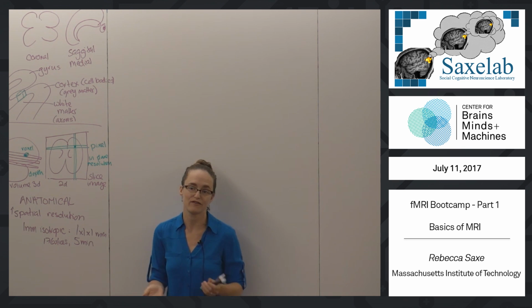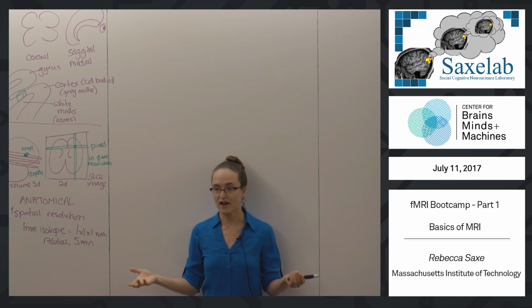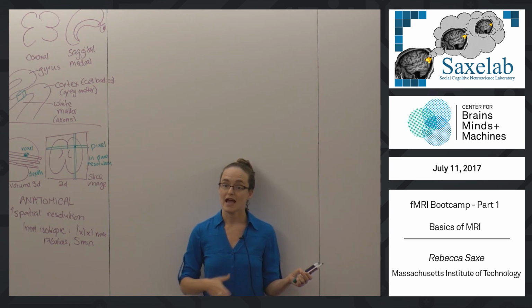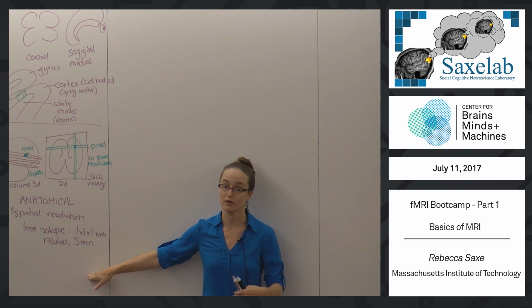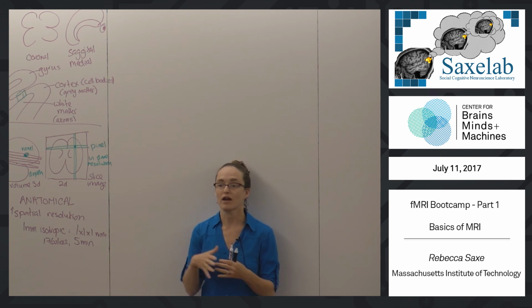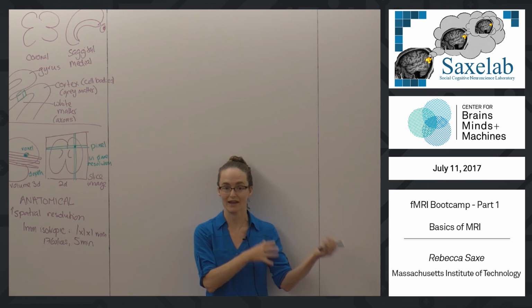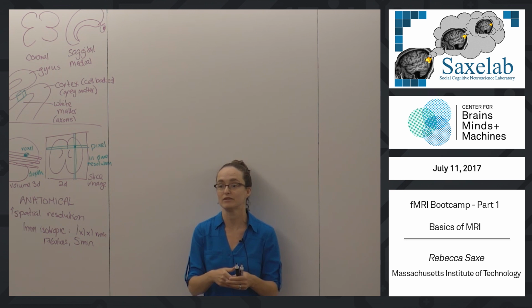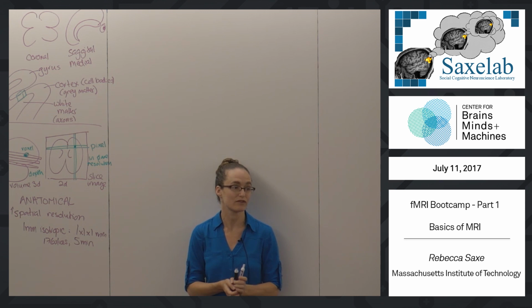And the current trade-off that most fMRI researchers are using is something like this: around 5 minutes, that's a good enough image for the things that we want to do with it. And we don't want to spend all of our scan time getting a better one because these data are often not the data we're most interested in. We're using these for basic reference, and so we want a pretty good image, but we're not using them as the core of our analysis. Labs whose interest is in brain anatomy will do a lot more anatomical imaging. Sometimes that means different kinds of anatomical images. Sometimes it means more of the same kind so that you can average them together and so forth.